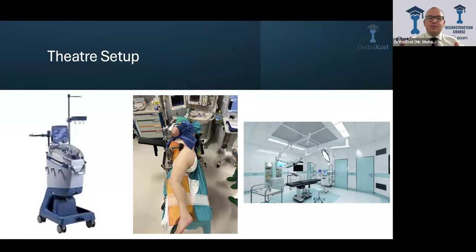Proper padding, ensure that the patient is resting on the table, ensure that the patient is safe. Everything has proper gel padding. There are no pressure points. Ensure that your supports are holding nicely and your pelvis is squared. Ensure that you have a full range of the hip before the support stops you. Ensure everything is in place. Ensure that your patient is cleaned nicely.